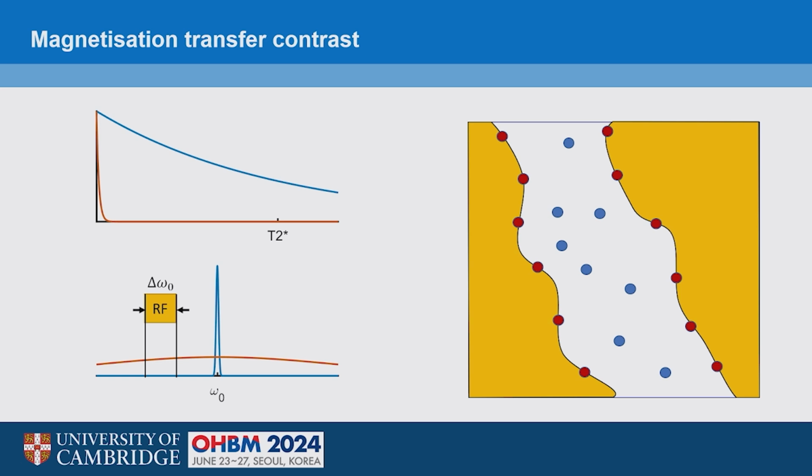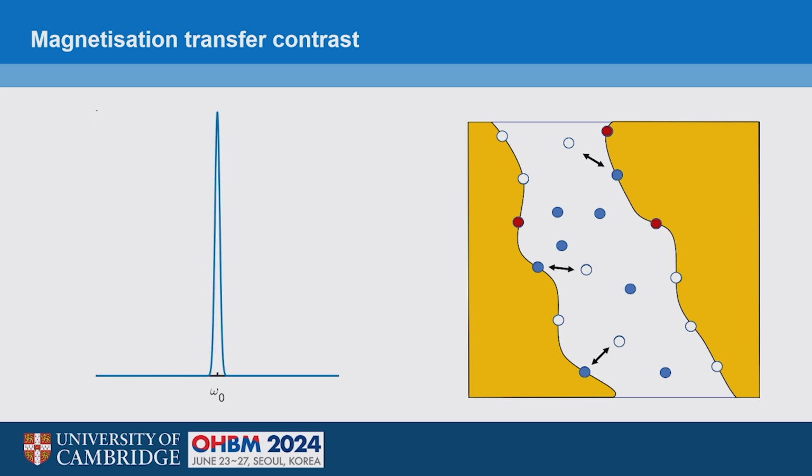But then when this exchange process that I mentioned happens, those saturated protons will not give any signal. So having fired the RF pulse, the signal from those becomes invisible. So when they swap with the free ones, that signal is going to be missing from what I detect. So if before I had the MT pulse, my signal looked like this, afterwards it would look like this, where there is a signal loss caused by the saturation transfer effect of my off-resonance pulse.